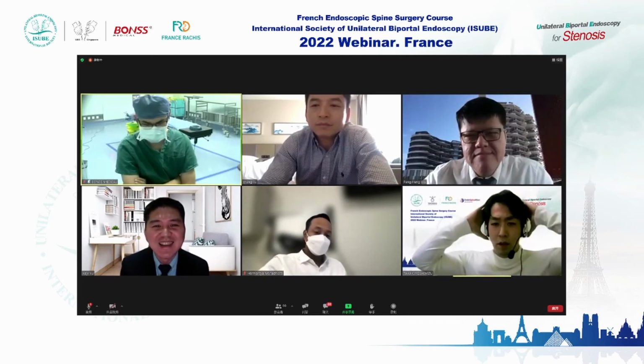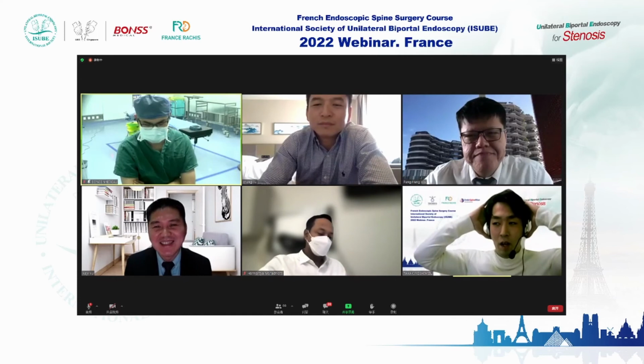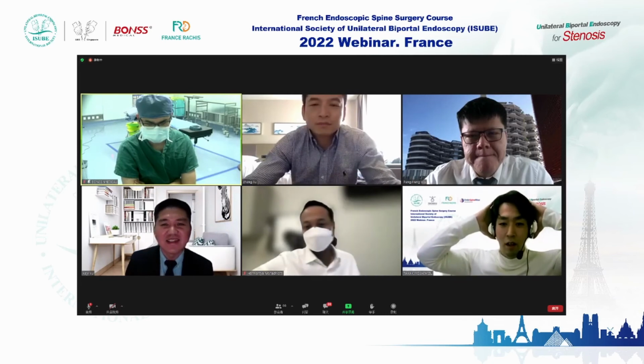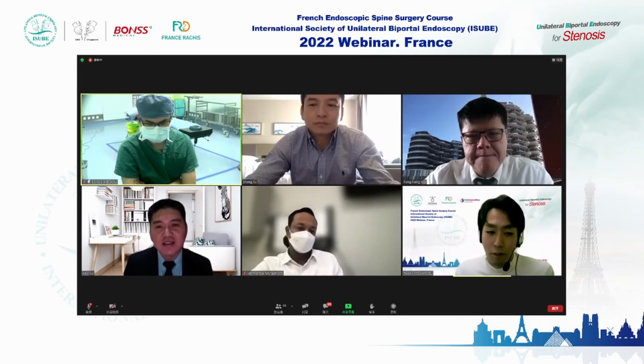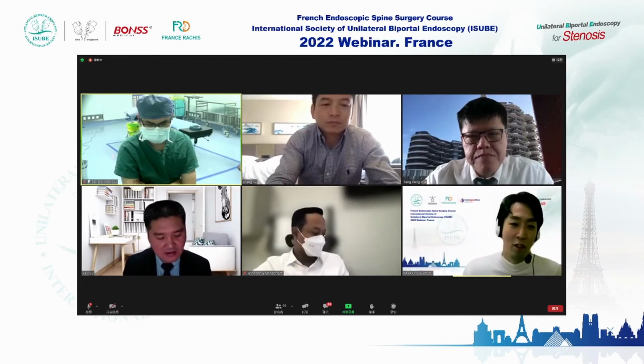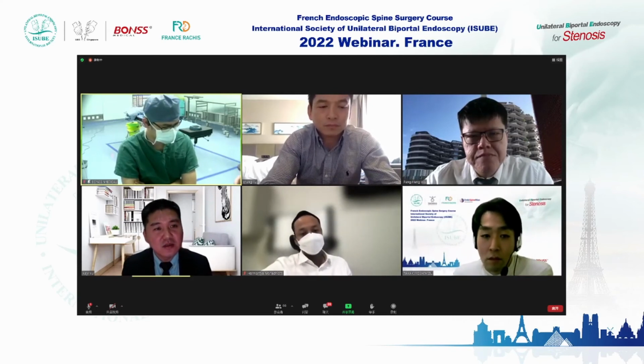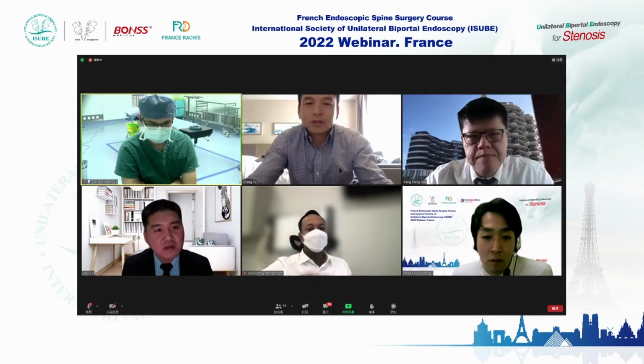The first case should be L5S1 herniation, which is the best for the first case. I think that's everyone's opinion. Liu, what's your recommendation?